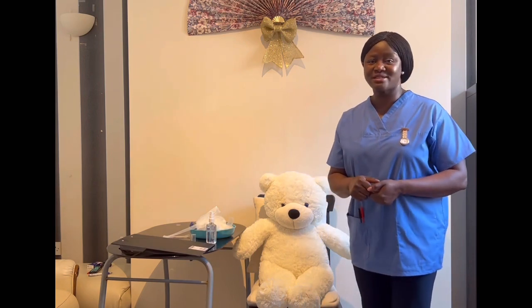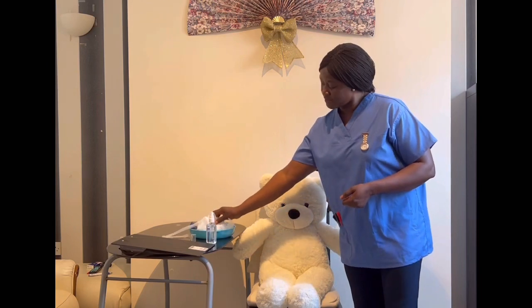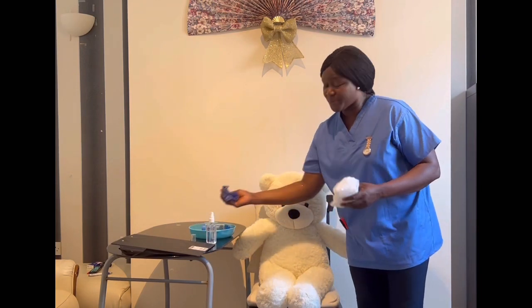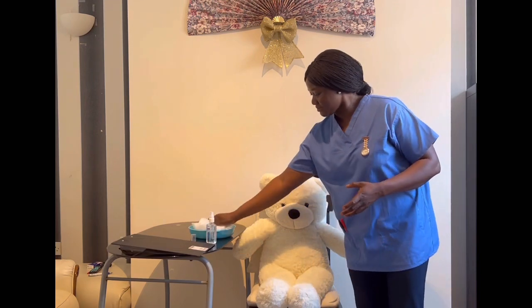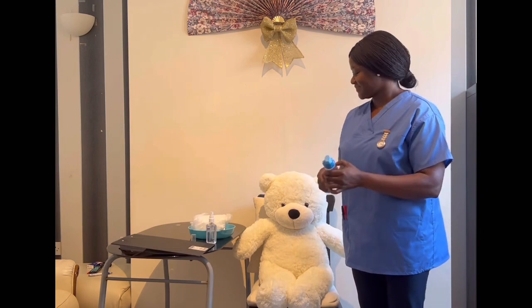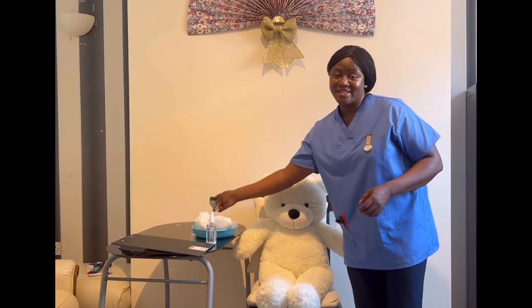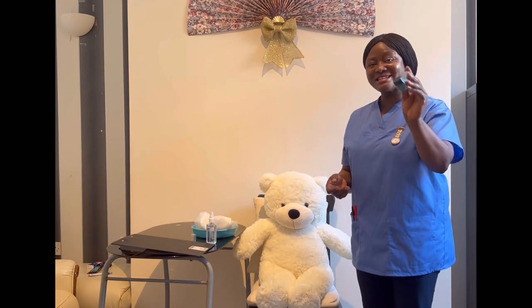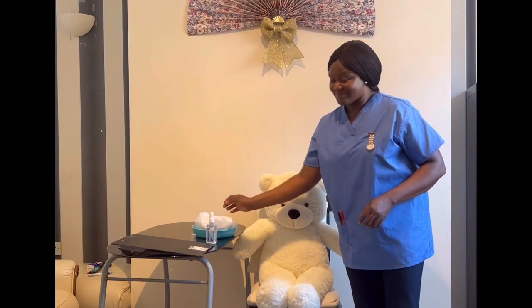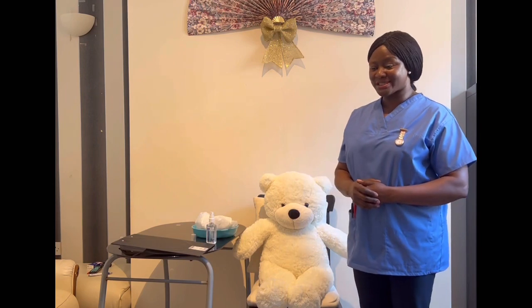What materials do I need for the skill? I need my apron, a pair of gloves, a spacer device, and a pressurized metered dose inhaler. How do I go about the procedure?